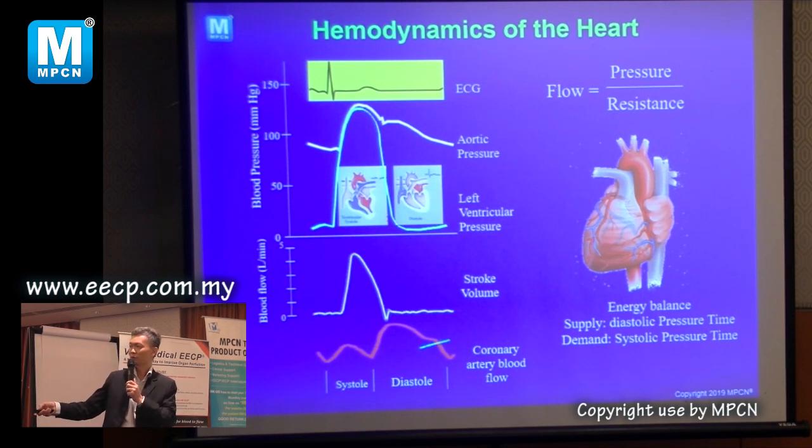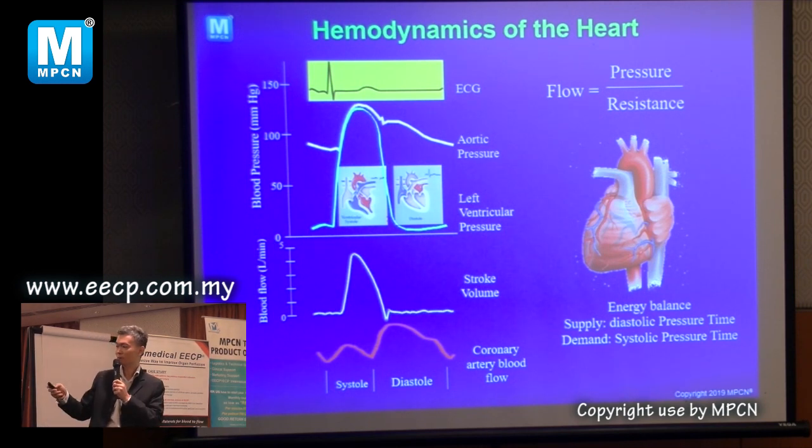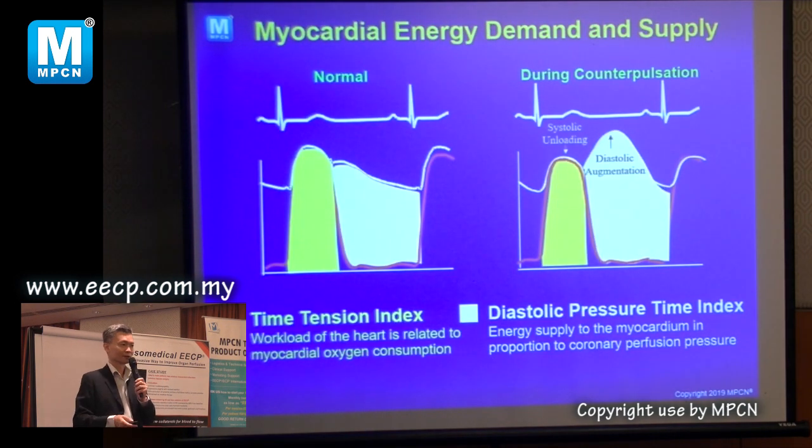So by increased blood flow there, the blood flow to the heart is stronger. The second thing it helps is by increasing the stroke volume, because when the machine comes down, there's some flow further down. You understand? Can non-medical people understand? Okay.